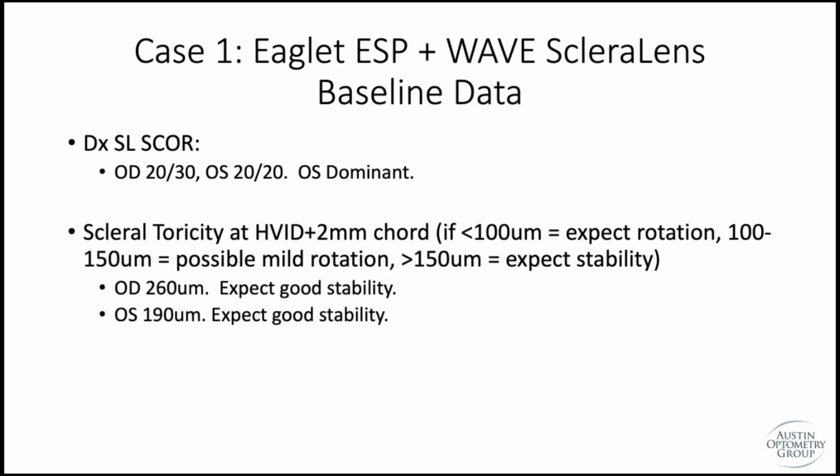You really want that midfoot to be where that balance is at. And so just based on where the HVID is, and then where the lens is going to first land, just beyond that, 2 millimeters, maybe 2.5, that's your sweet spot, the middle of these landing zones. So that's really where that support is from. So you'll see that reference there.